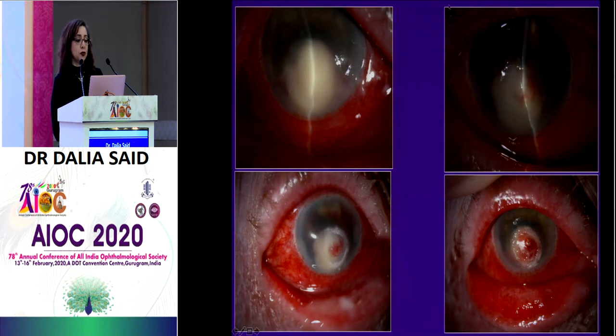Again, if you use corneal gluing in a case of infection, you have to be wary because we do put a bandage contact lens on top, and sometimes your antibiotic will not penetrate very deeply with a bandage contact lens in. So you have to monitor the infection because it can get worse, and if it does, you have to remove the bandage lens. And it's very, very useful to put a very thin layer of glue, and I'll show you how to do that, because if it's rough and you have to take off your contact lens, then the lid movement will dislodge it.